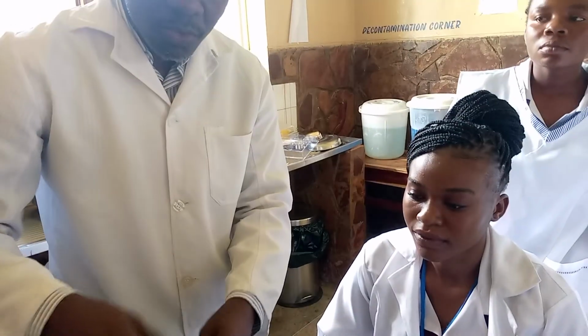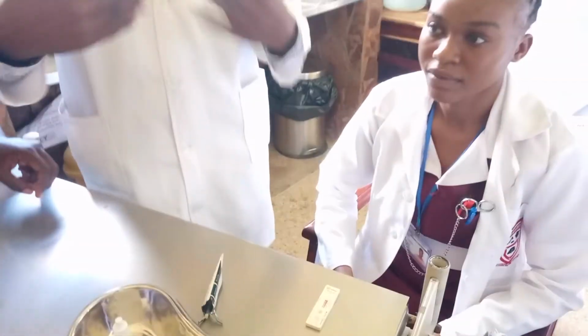But then what you need to do, since you have touched the patient, you have to dismantle and also wash your hands. So you're going to wash your hands the usual way. Okay, that's what we do for this test.